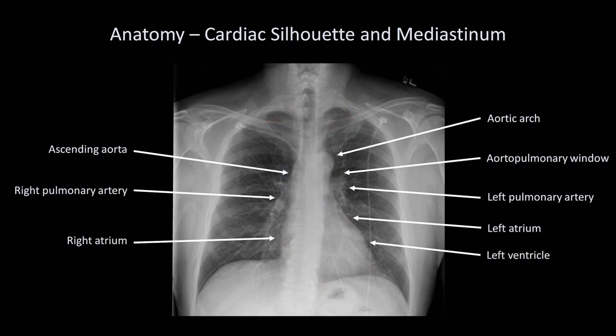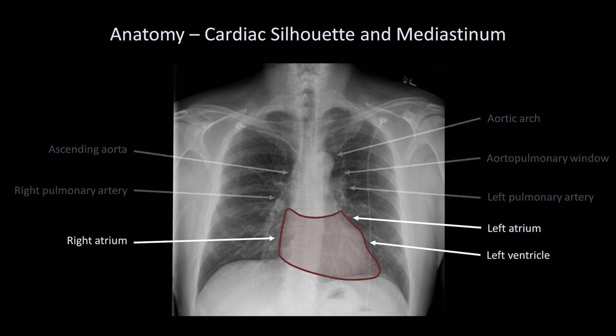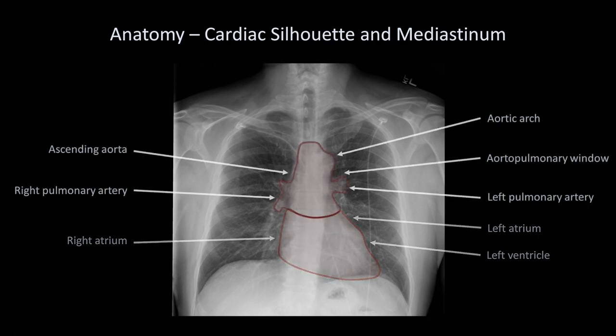This video will be divided in half. The first half will cover abnormalities of the heart. The second will cover abnormalities of the hila and the remainder of the mediastinum.